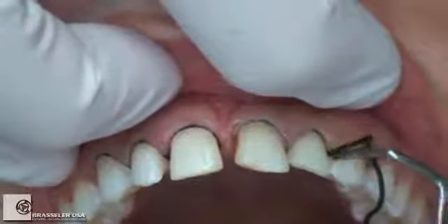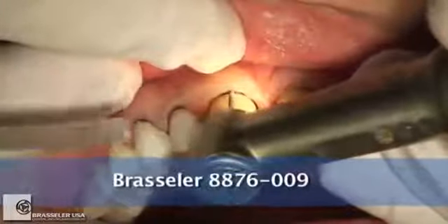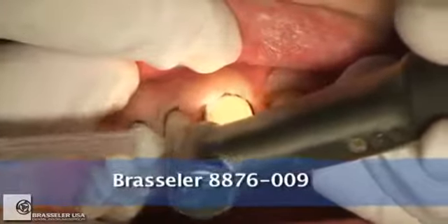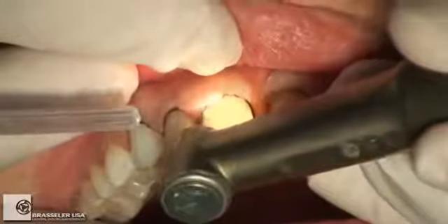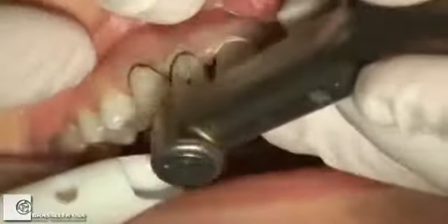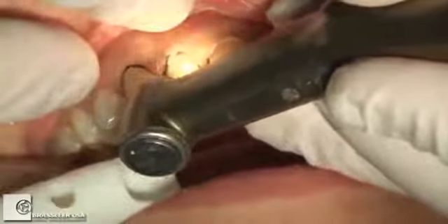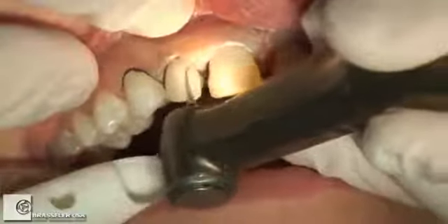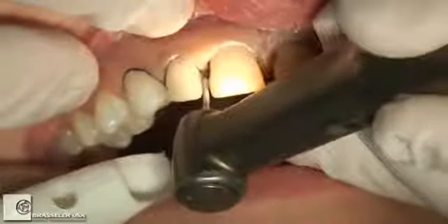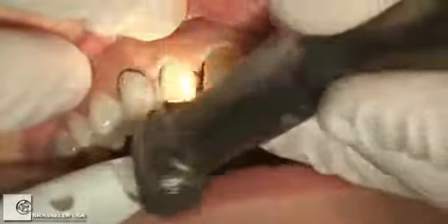Since we had a moderate diastema there to close after we removed the bonding, I used 2 separate pieces of cord. If these teeth were well juxtaposed or had good interproximal contact, I would have just used 1 long piece of cord. All right, now I'm just going back along and finishing an area that I see that maybe I had a somewhat corrugated margin where I wanted a nice, smooth, even margin to follow the finish line. I want to make the job easy for the laboratory ceramist if I'm going to go ahead and prepare, which we are in this case.